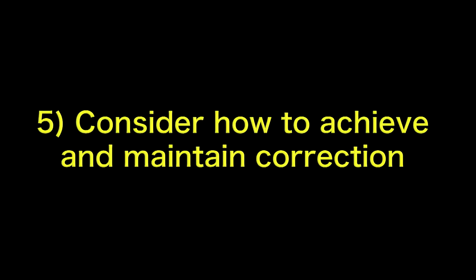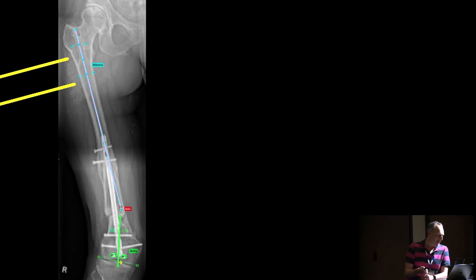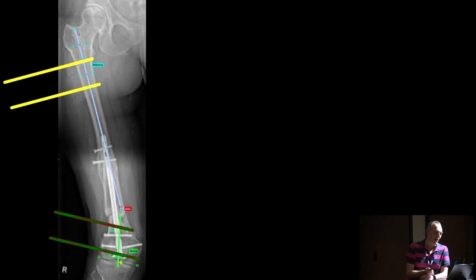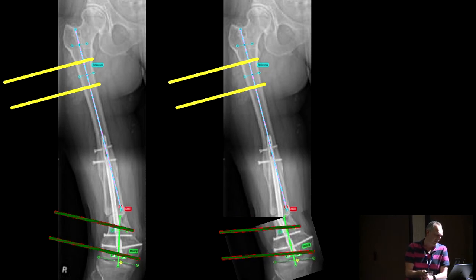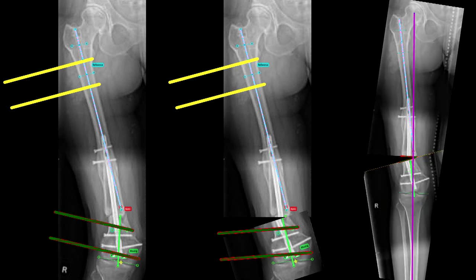Finally, think about how we're going to achieve and maintain the correction. We've seen this done yesterday, so our plan was to put a monolateral rail-type fixator on. Notice that I've put the pins parallel to the joint rather than at 10 degrees. I'll show you how I was going to accommodate that later. We talked about that in some detail yesterday, but actually it depends how you're going to line the pins up on the frame. And then we've planned to correct that. You can see that plan looks quite like the plan which we had from our original deformity planning software, yeah?